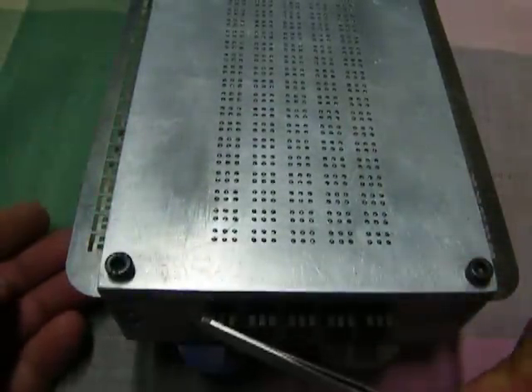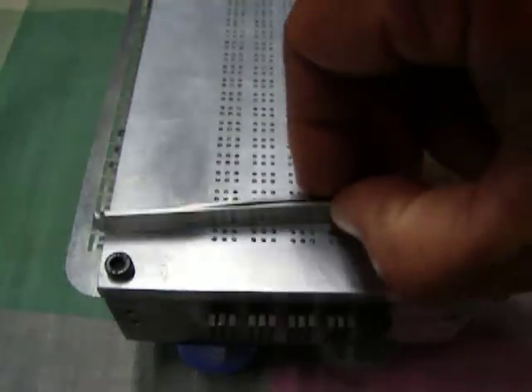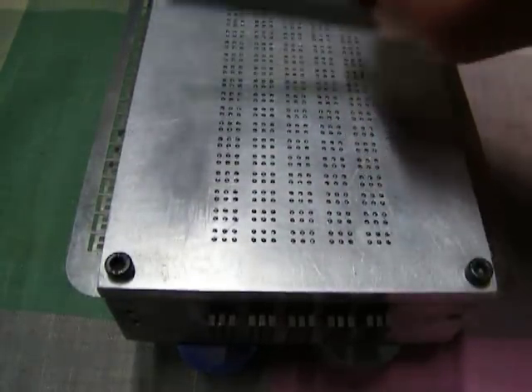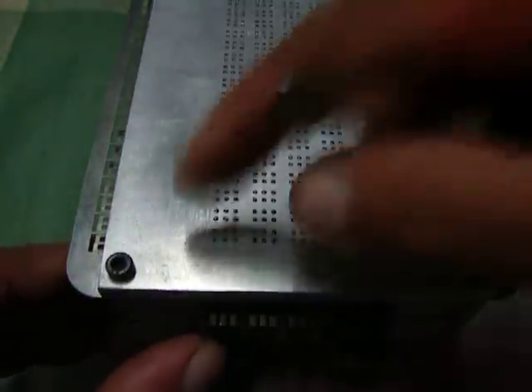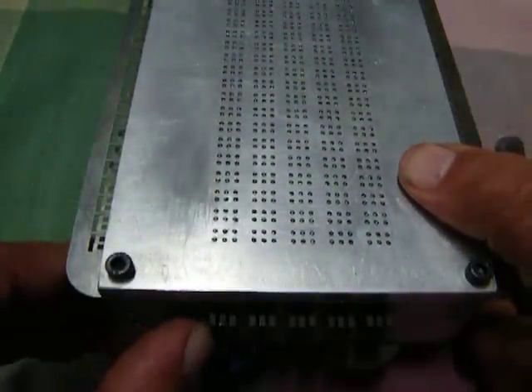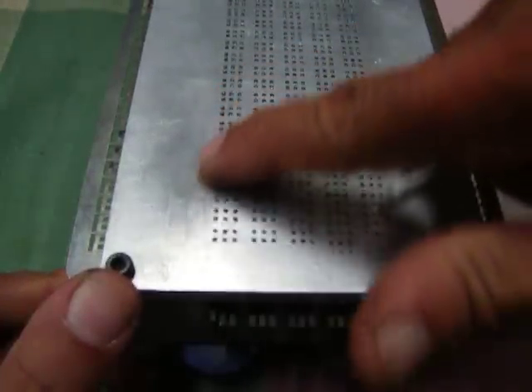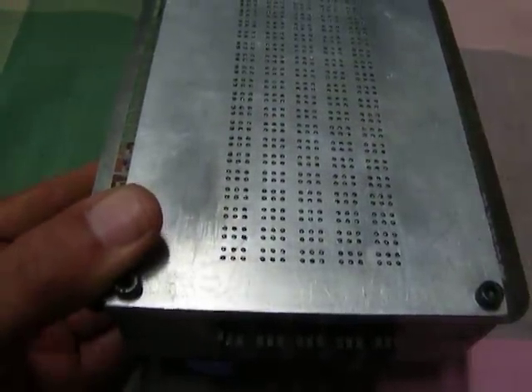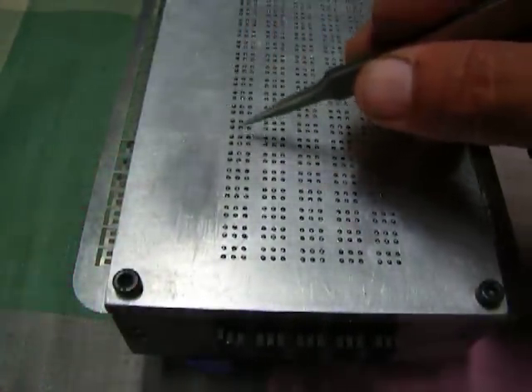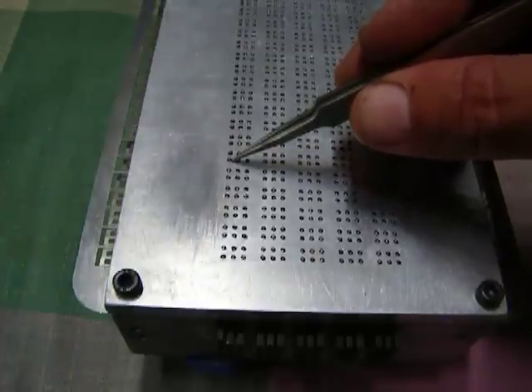These over here are the row actuators. Those column actuators come under the pins this way. So the row actuators, if you look, I'm going to press one with the first one for the topmost row over here with my thumb, and you'll find that there's no actuation over here for the first five cells. But if you can look carefully, I'll try and zoom in for cell six onwards. Cell six starts here. I think that's cell six.